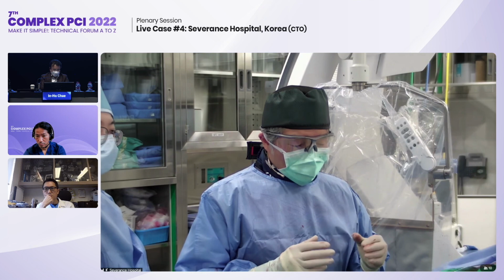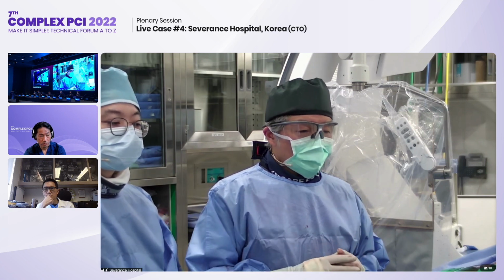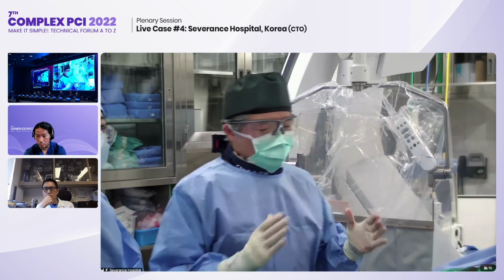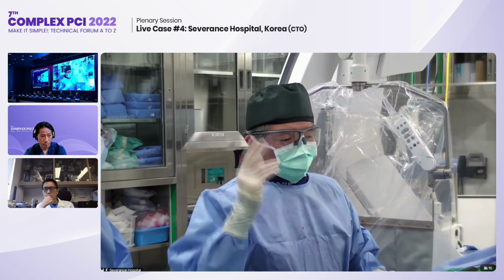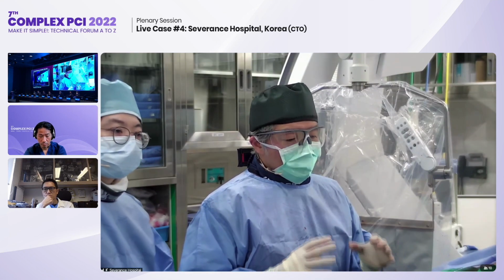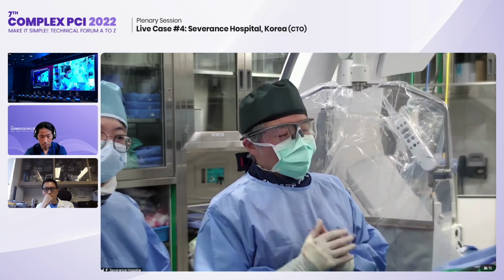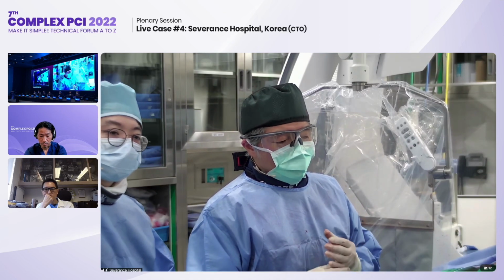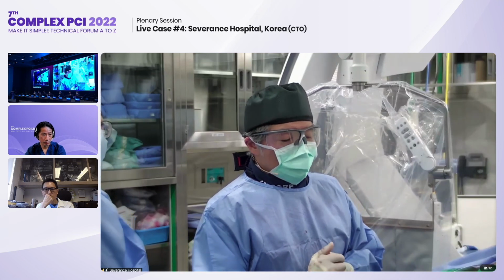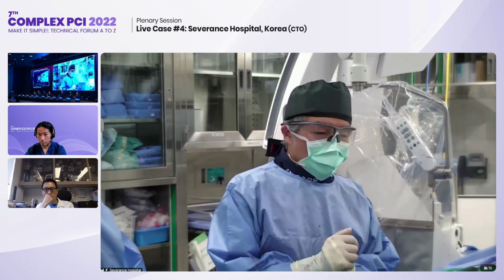Okay, from our KCTO club, we had many discussions with Professor Che and Professor Hyuk-jun Yoon. The main focus for a successful reverse CART: even though sometimes we got tired from the long time, step by step, means starting with an initial small-sized balloon. Also Habara mentioned that IVUS evaluation is very good to decide the balloon size. If not possible, a small size would be better for the initial start. After a successful reverse CART, the next step is imaging evaluation using IVUS. So I will do the externalization with RG3, evaluate using IVUS, and then, based on the better size, decide the stent size and stent length. That is my future plan.